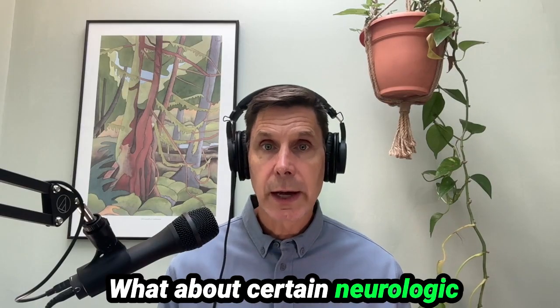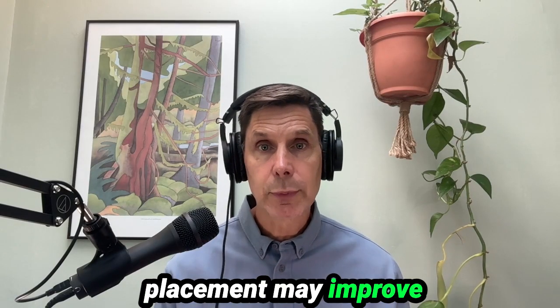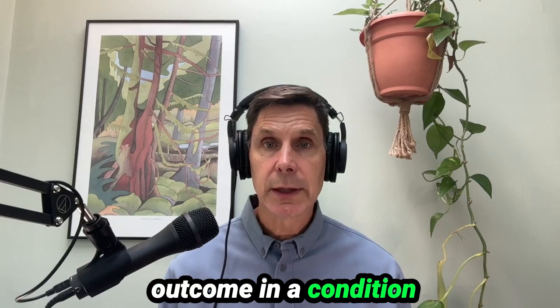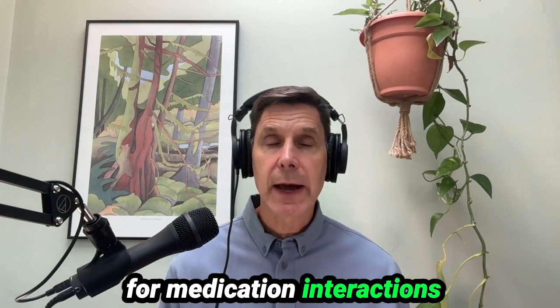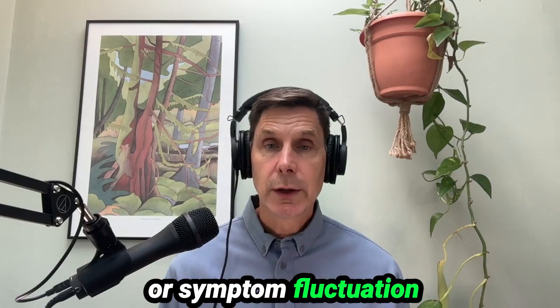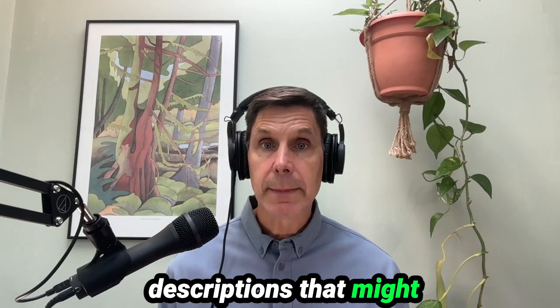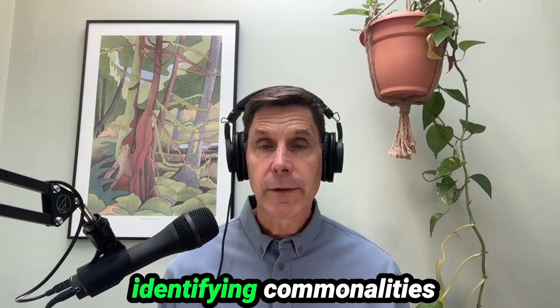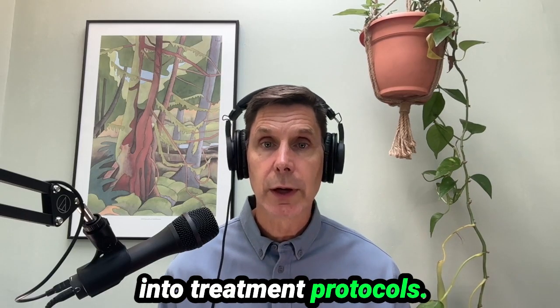What about certain neurologic or psychiatric conditions? Well, custom electrode placement may improve outcome in a condition-dependent manner. So, for example, monitoring for medication interactions or symptom fluctuation during tDCS can lead to descriptions that might be important in terms of identifying commonalities that can then be integrated into treatment protocols.